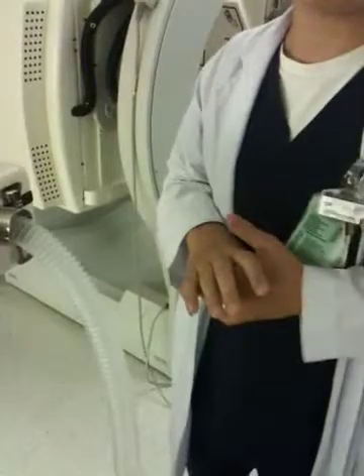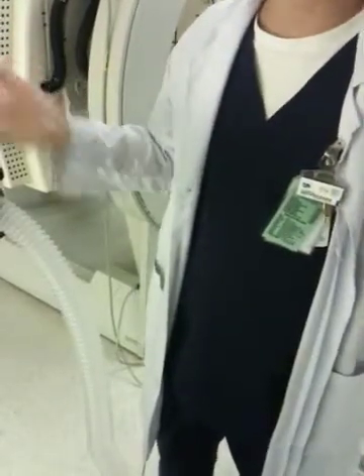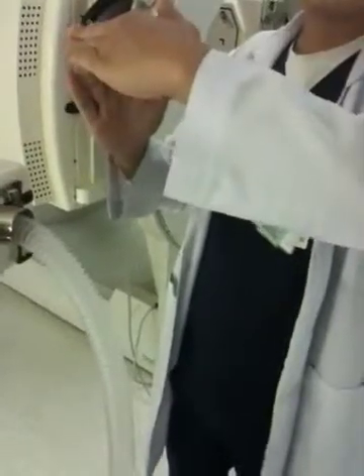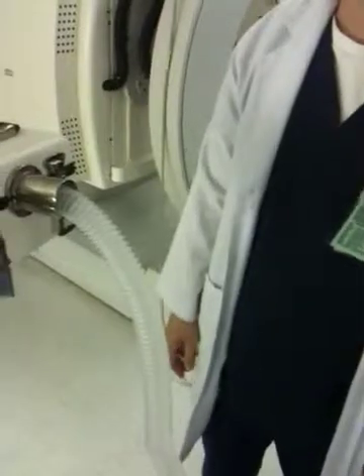Then start getting an MAA ready. You need 5 millicuries of MAA — you want to overshadow the counts of the DTPA. Inject 5 millicuries; make sure you flush all the dose in there because sometimes not enough stays and you don't get enough counts. Just make sure you flush it all real good. Inject the MAA, start from the same position you finished with the vent — anterior right — then go back: left, RPO. The same views you did on the vent should be the same on the perfusion. Go for 500,000 counts on the perfusion. After you're done, just display the pictures.